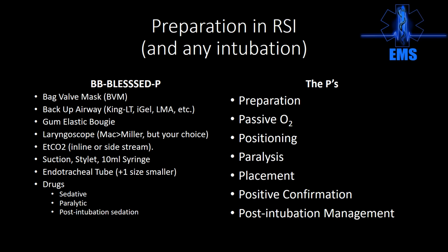Of that 10 mLs, you don't need 10 mLs of air. You need about 7. So do not fill this thing up like a Macy's balloon on Thanksgiving. Just fill it up with about 5 to 7 mLs. Your pilot balloon, that little balloon that comes off the tube there, confirms that your balloon is up at the distal end. It needs to be pliable and should yield to gentle pressure. You should not squeeze that thing like you're popping a zit on Dr. Pimple Popper.